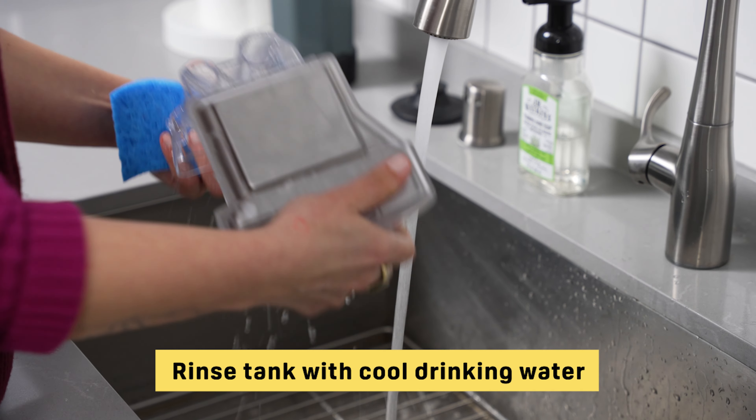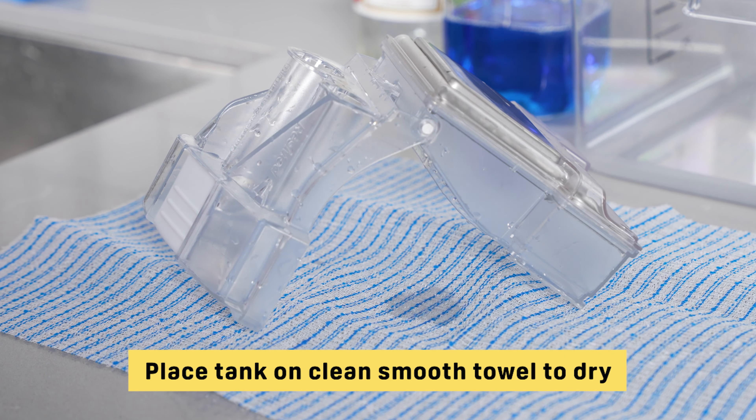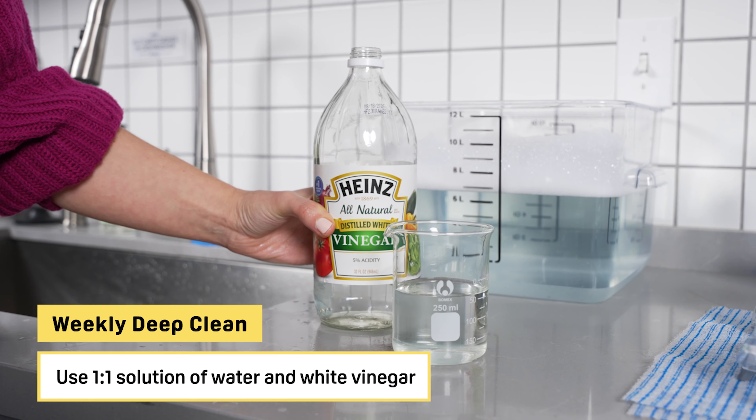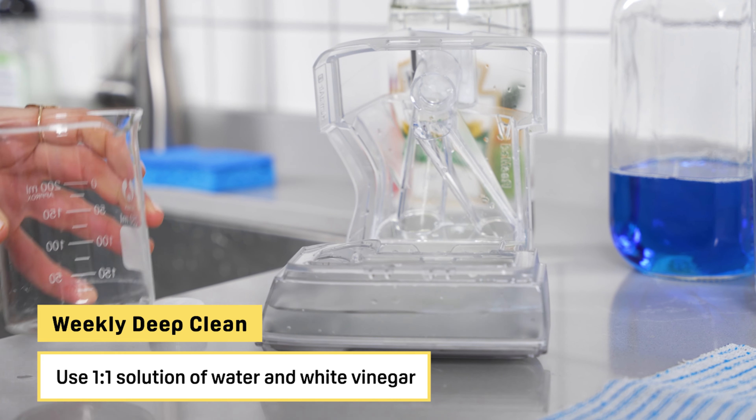CPAP machines like these are used to treat obstructive sleep apnea. If you use one regularly, you'll know how important it is to keep all of the pieces in your system clean. It's important that you clean your CPAP masks, hoses, and humidifiers on a daily basis to prevent the buildup of microbes, mold, dust, and debris.